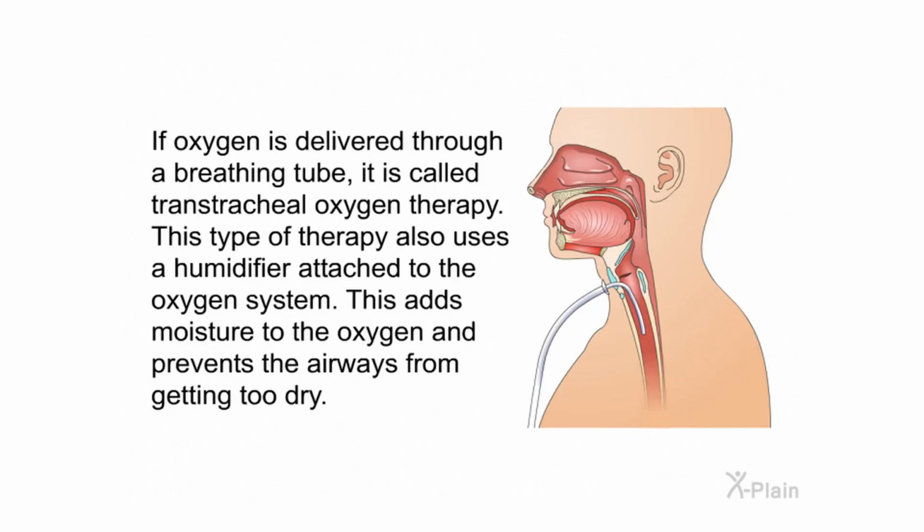If oxygen is delivered through a breathing tube, it is called transtracheal oxygen therapy. This type of therapy also uses a humidifier attached to the oxygen system. This adds moisture to the oxygen and prevents the airways from getting too dry.